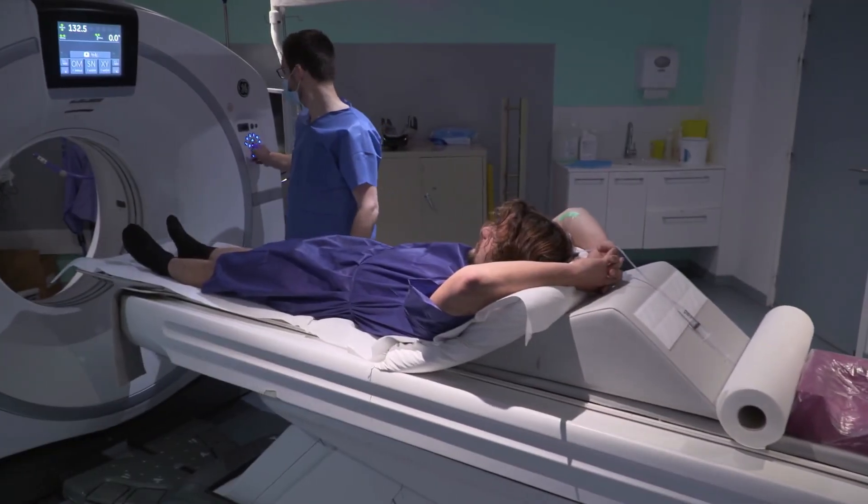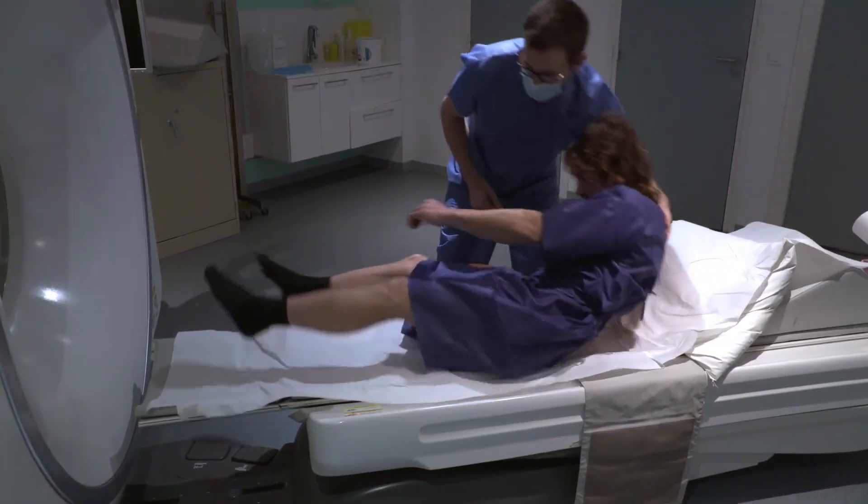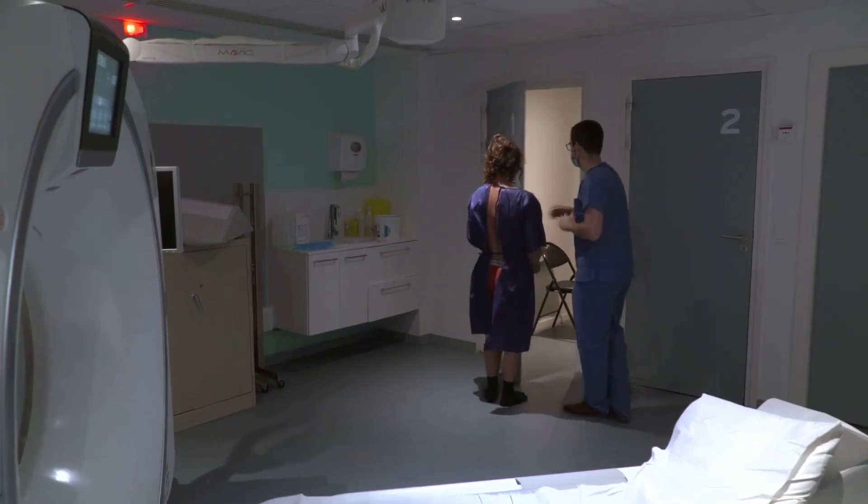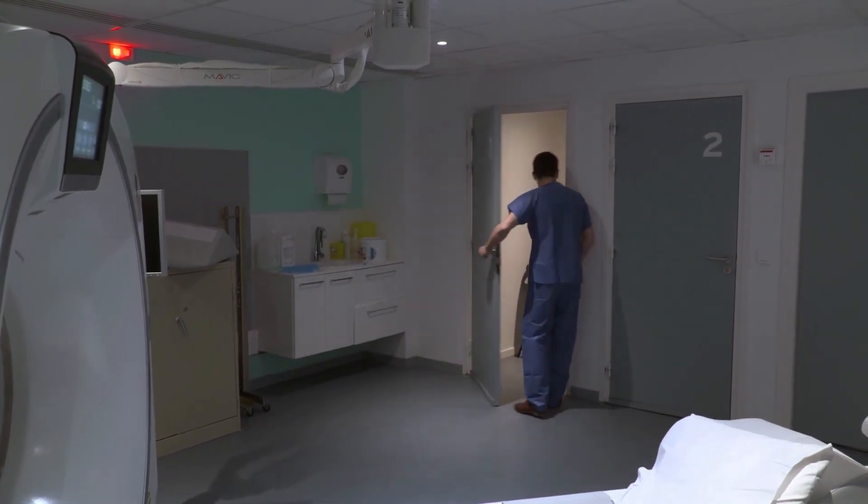At the end of the examination, accompany the patient back to the changing room and tell them to get dressed. Provide the patient with any post-examination instructions as indicated at your facility.